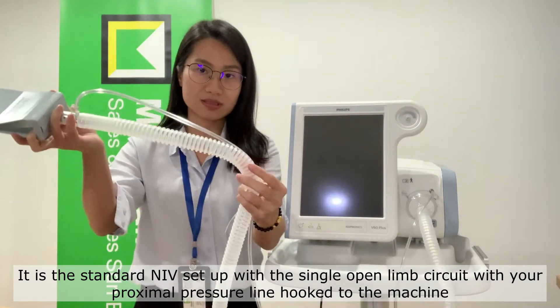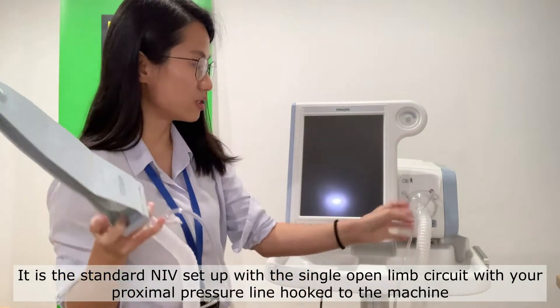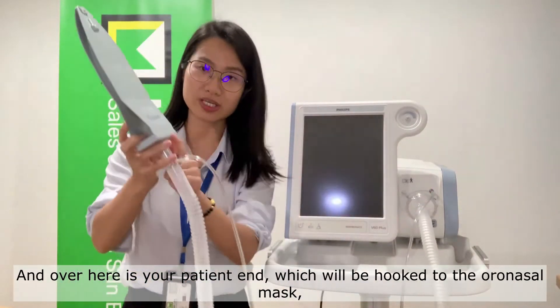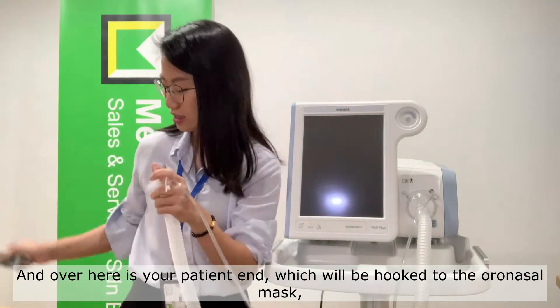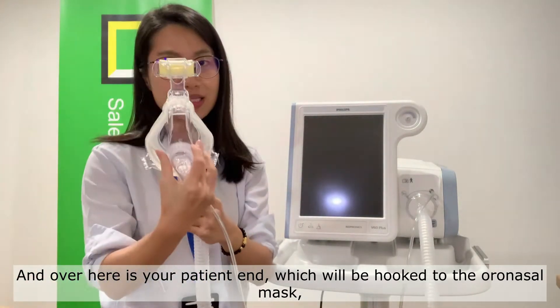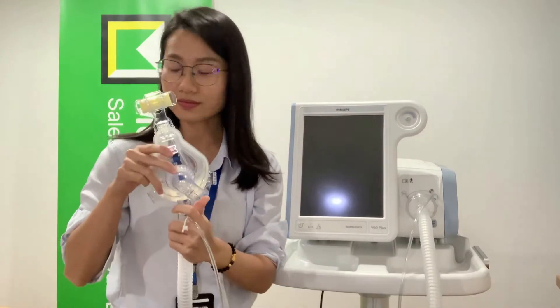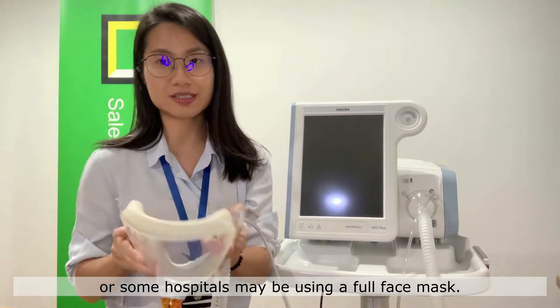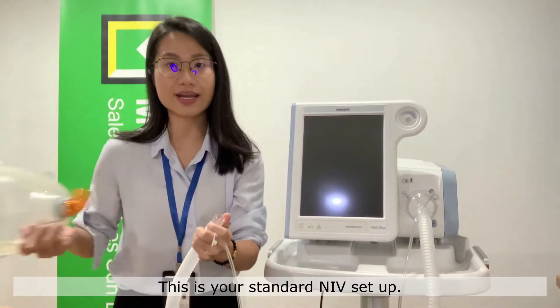Single open limb circuit with your proximal pressure line hooked to the machine. Over here, which is your patient end, this will be hooked to your NIV mask, which could either be the oral nasal mask or, as some hospitals might prefer, the full face mask. This is your standard NIV setup.